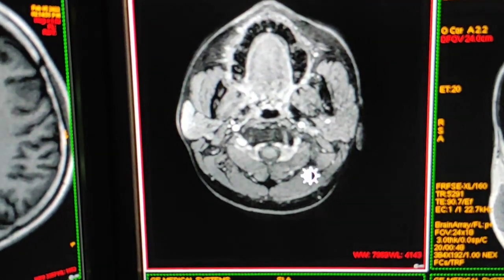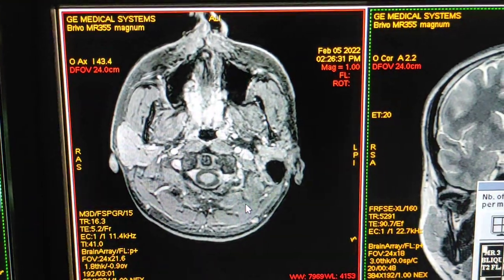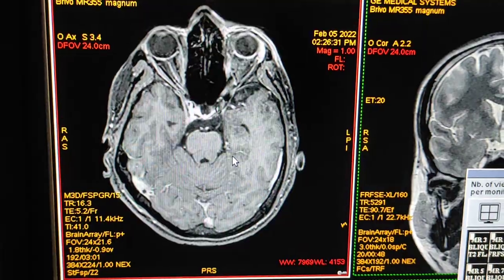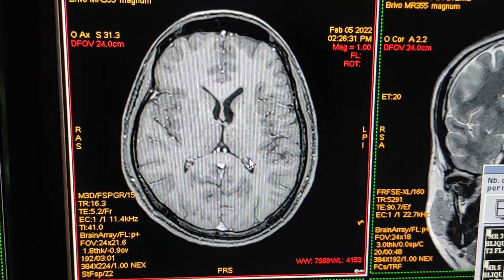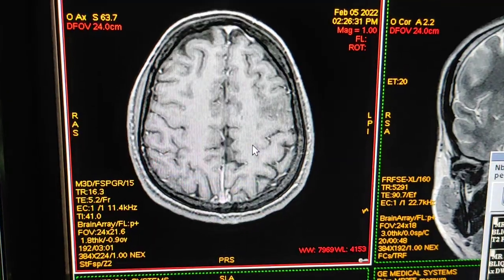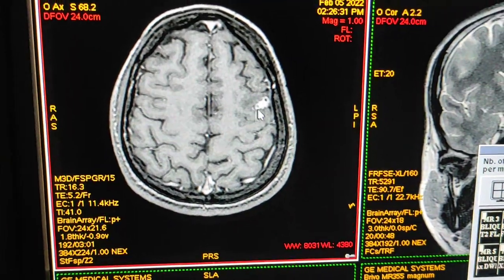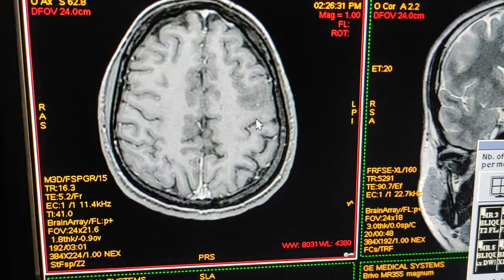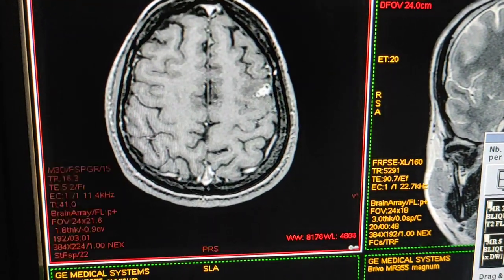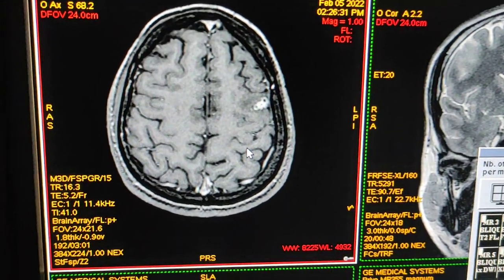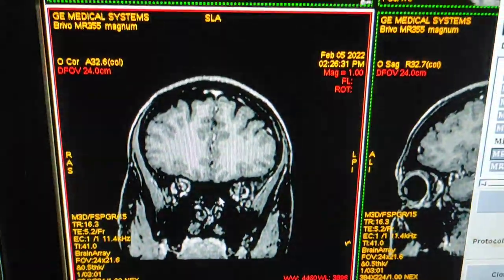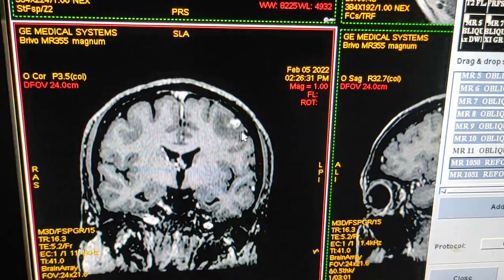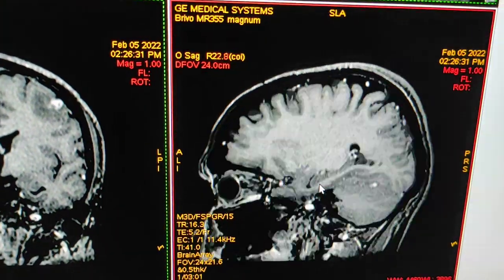I have taken 3D post-contrast axial images. After post-contrast, I will show you enhancement of the lesion. Here you can see multiple matted granulomas — these are tuberculomas. As you can see, after post-contrast the lesion is enhancing. I will show you coronal images — there are multiple lesions. This is the sagittal image.